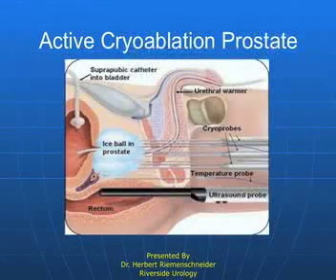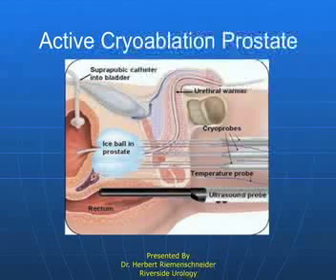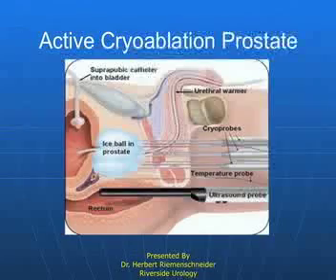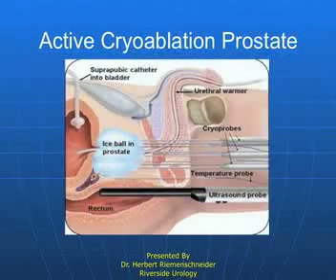Here is a graphic representation of this process in action. This is the ice ball, and as you can see, it conforms well to the prostate, and that's because of the ability to freeze and thaw, which gives us the ability to sculpt the ice ball. We also have thermistors, which tell us what the temperature is between the prostate and the rectum, so that we don't damage the rectum and yet freeze the prostate completely. And the other thermistors tell us about temperatures such as in the sphincter.